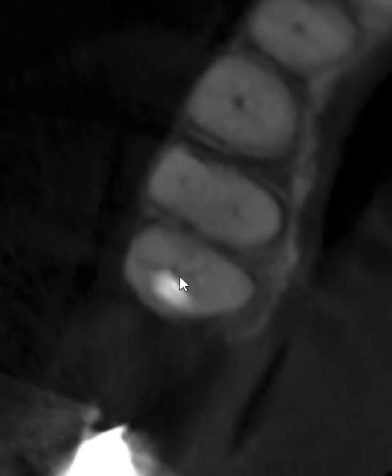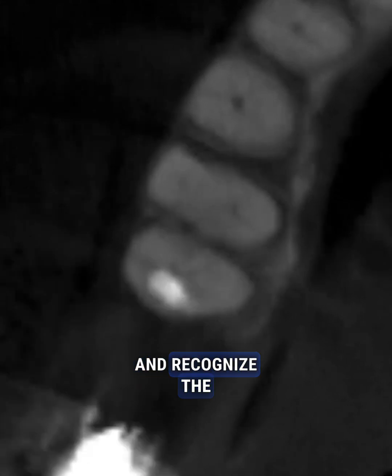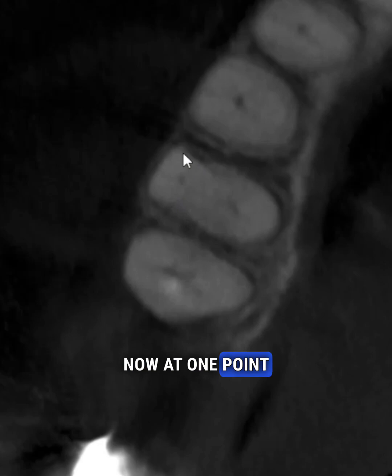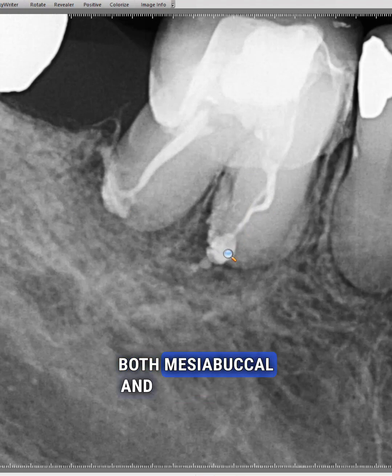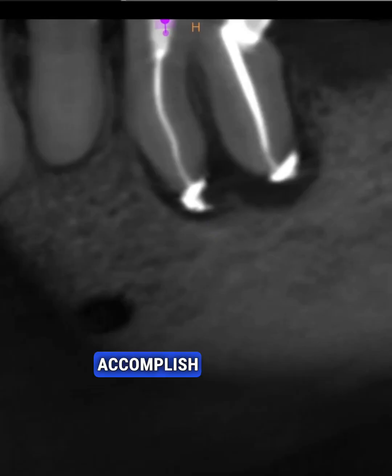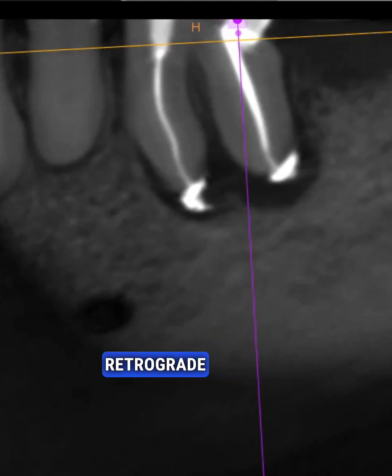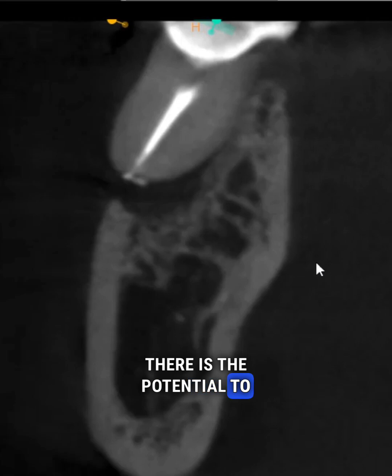But here's the thing. Sometimes we can be astonished by technology and recognize the grace it provides. So I never found the mesiobuccal canal. Now, at one point, I did stop looking because I have had the instance in many cases. You can see here on the mesial, both mesiobuccal and mesiolingual are filled. There's two canals there. So what happened here? Well, I was able to accomplish what I like to call non-surgical retrograde cleaning and sealing. With the laser technology, there is the potential to clean upwards.